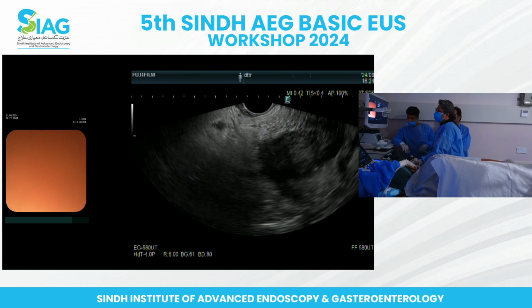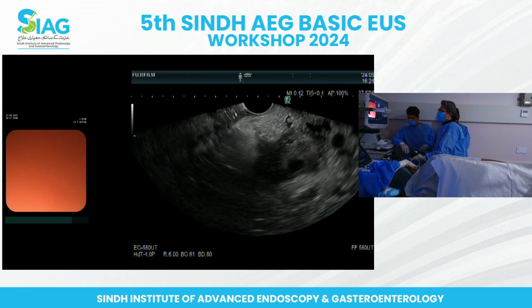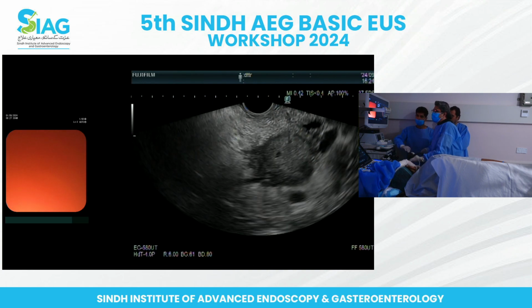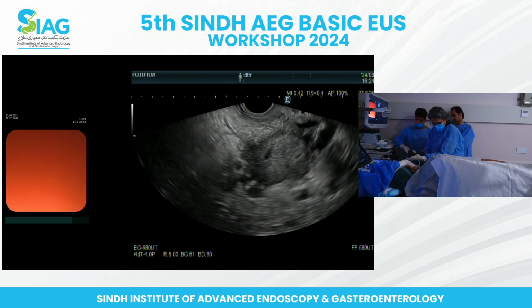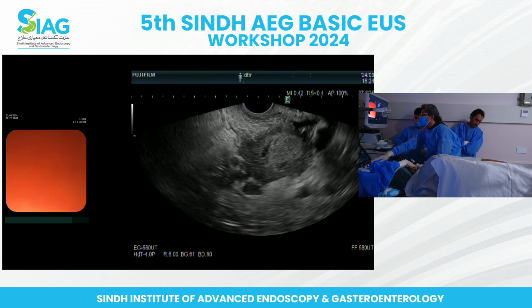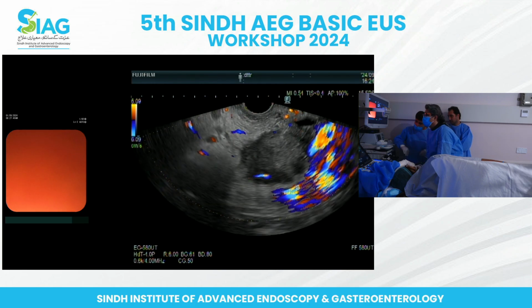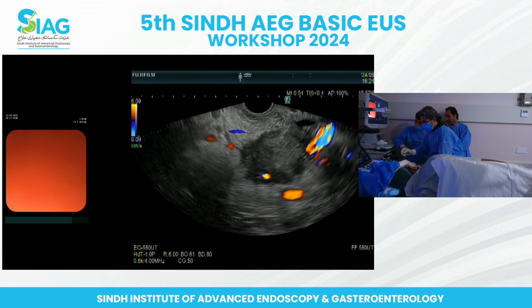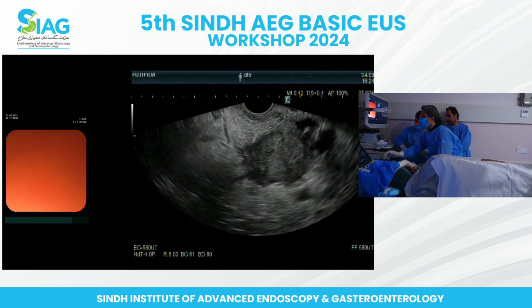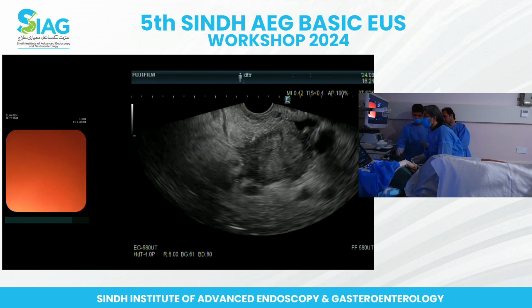True. Let me just try. Whatever you feel comfortable. If you want to do it from the other side, that's fine. We can certainly try, but the difficulty here is, if you can stabilize that, that's really good. At this point, I have full big wheel down towards me, so I'm going to have to relax it a little to have a needle out.